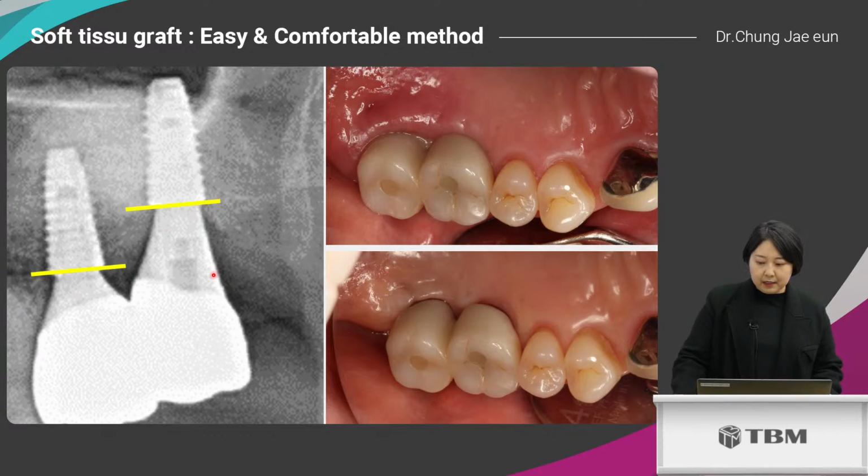Although the crown margin has been raised a bit here, there is always a risk of peri-implantitis. It often swells like this. It seems necessary to reduce the soft tissue dimension a little through palatal thinning like this, so we can maintain the peri-implant health.